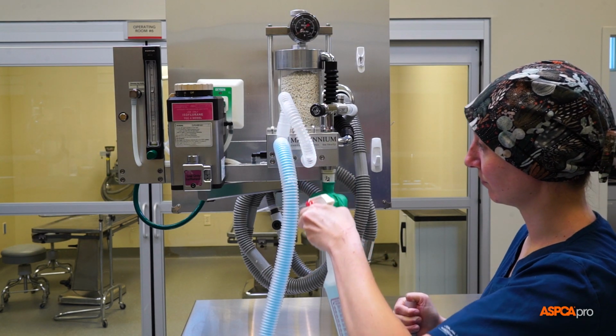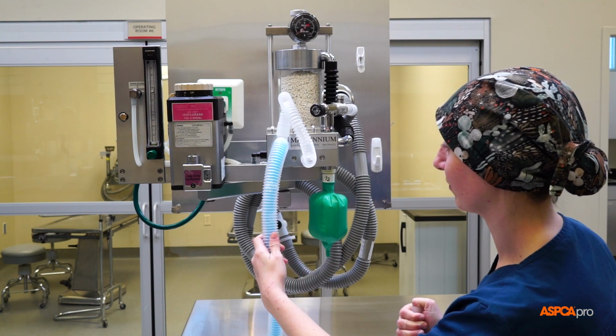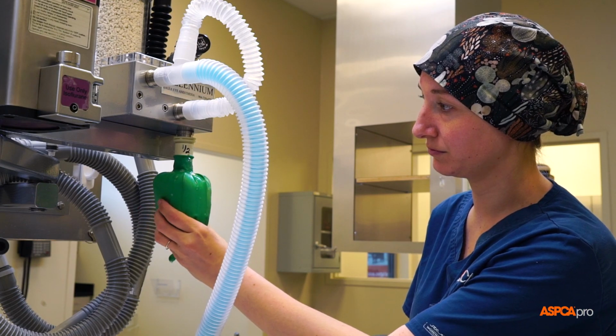One way to do this is to follow the flow of gas through the anesthesia machine and spray the route with soapy water in all suspected areas. Bubbles will form if a leak is present.